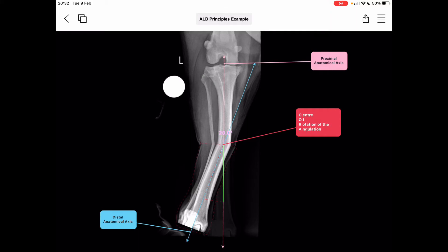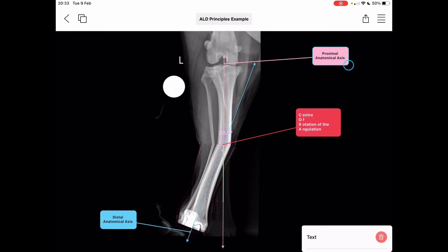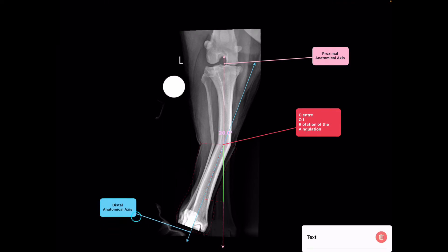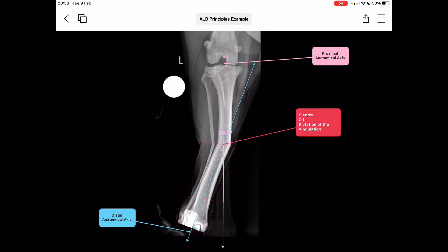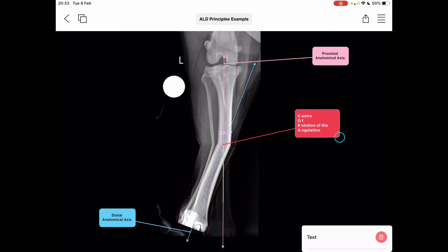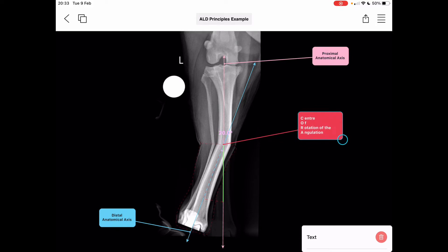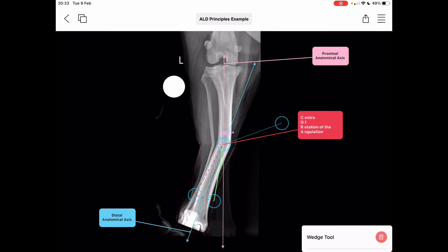In this projection, we've used the VPOP annotation tools to demarcate the proximal anatomic axis in pink and the distal anatomic axis in blue. These two anatomic axes intersect, and where they intersect represents a key point of interest. It's a central point where, if we were to rotate the image about that axis point through the screen — the plane of the deformity — by the angle of the intersecting lines, we would be able to correct the deformity. That is a CORA, and every CORA has an angle associated with it called the magnitude of the CORA or deformity — in this case, 20 degrees.